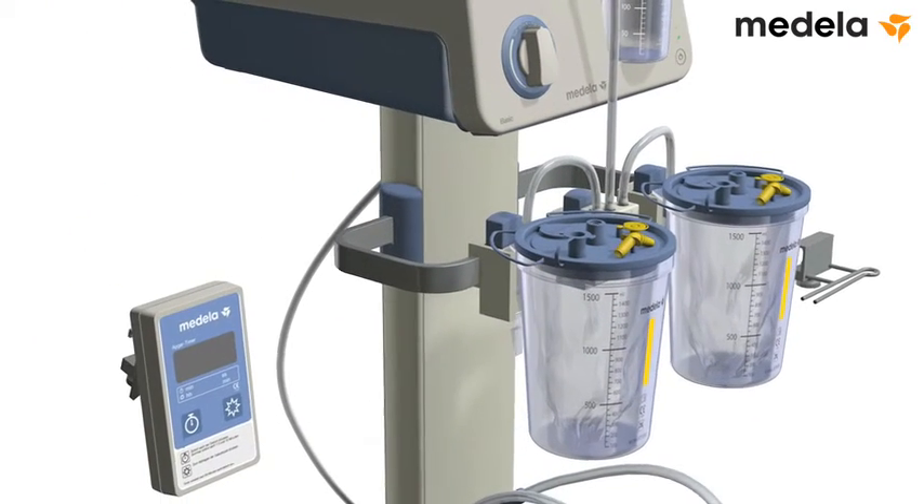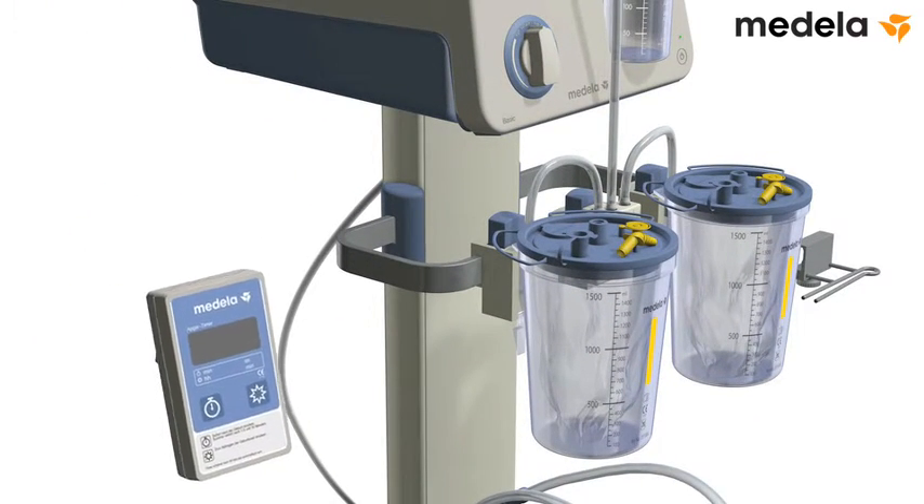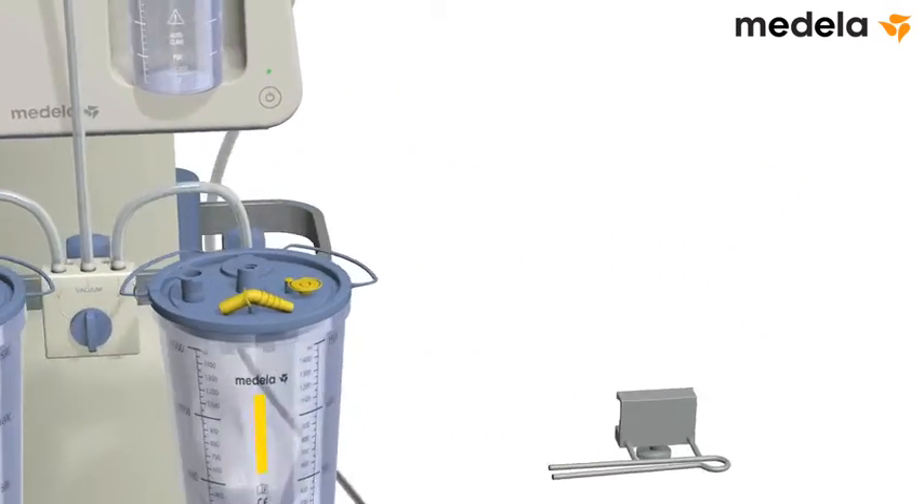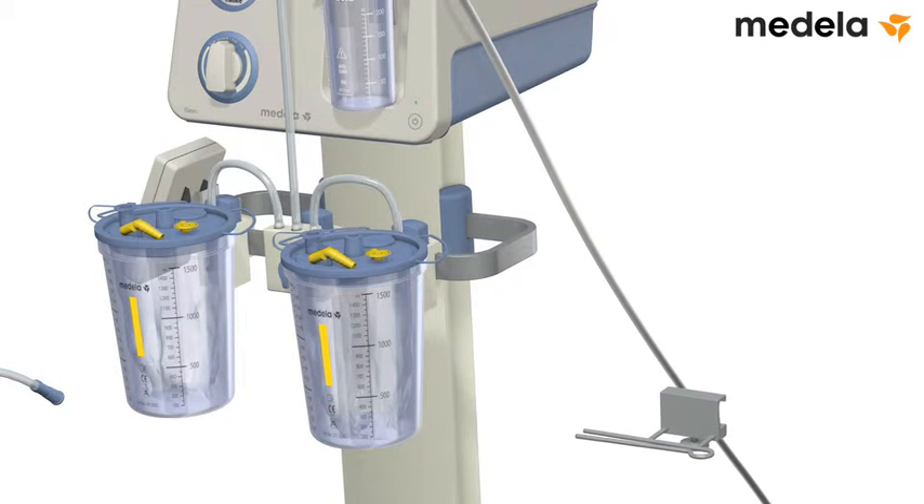Attach the APGAR timer. The recommended position is on the side rail. Attach the tubing holder on the other side rail.